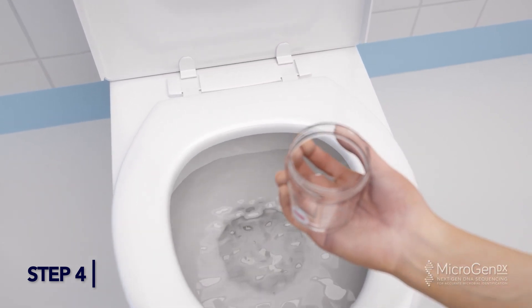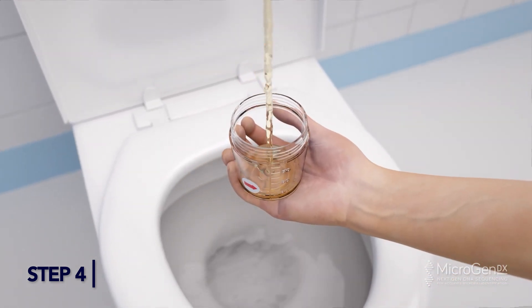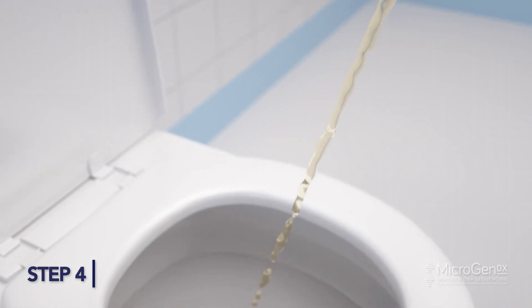Stop urination part way through, then continue urination into the cup. Keep urinating into the cup until the amount is level with the red arrow sticker. Do not fill the cup more than half full. Finish urinating into the toilet.